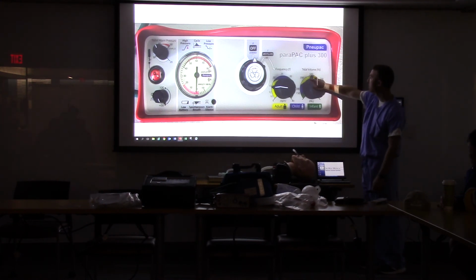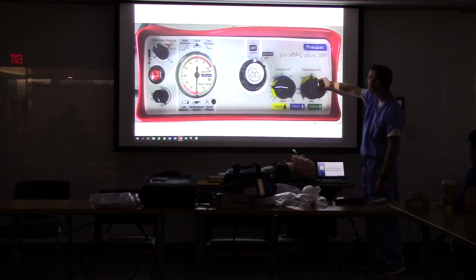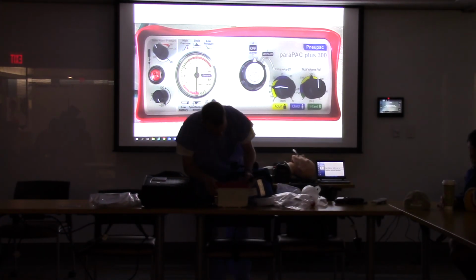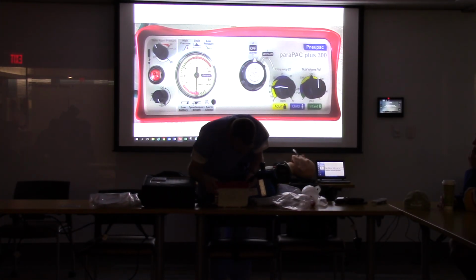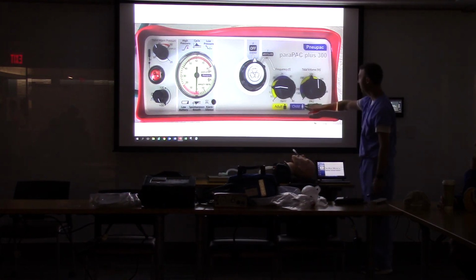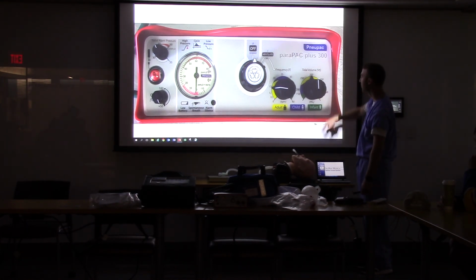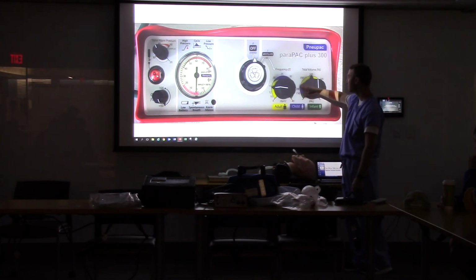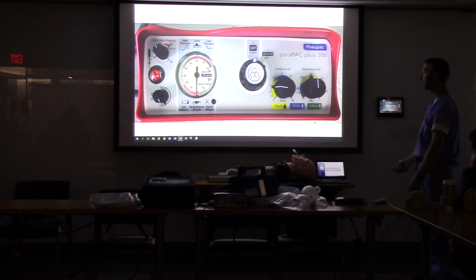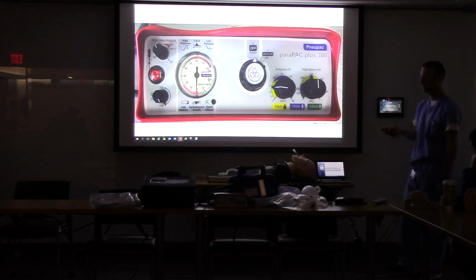So if you remember that chart, most people fall in this range, which is old school thinking that goes all the way up to like 1200 cc's. You do not need that much. At most, this should go to like here, and after that, it doesn't allow any more because this is all just danger zone. And most peds and infants are down in the 200, 150 range. Hopefully you're not transporting them, and children's just comes to pick them up because they have much better, much more sophisticated ventilators than these ones.